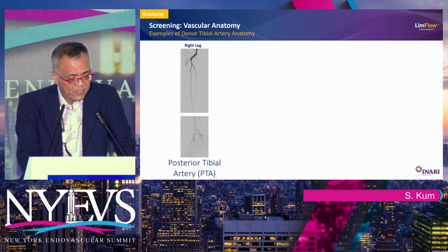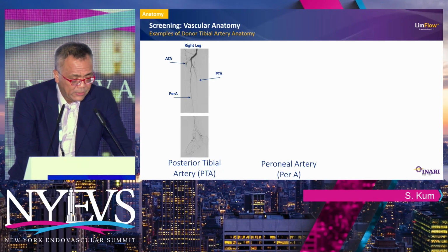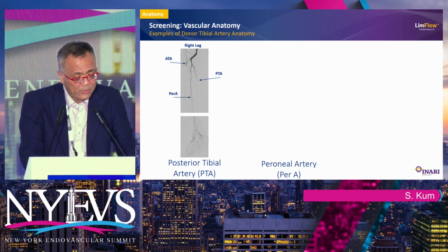Screening anatomy, if you have a typical patient like that, we like the posterior circulation, so this is the anterior occluded posterior, you're just adding blood to the equation.